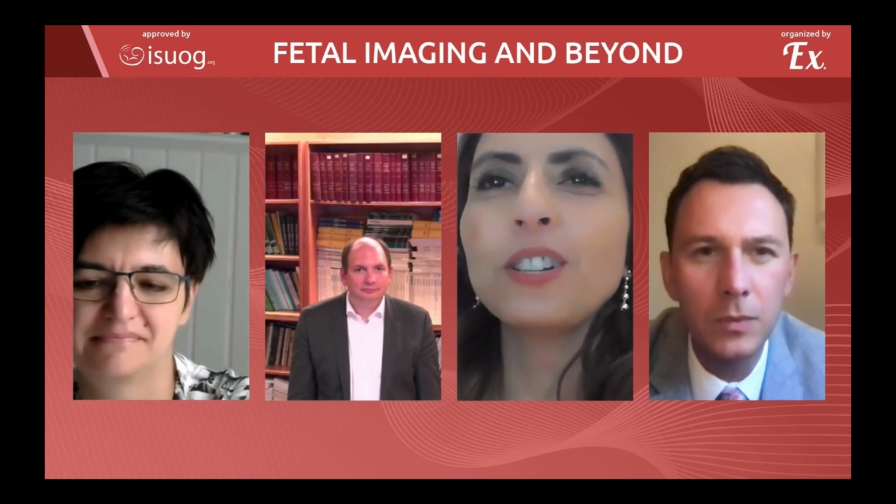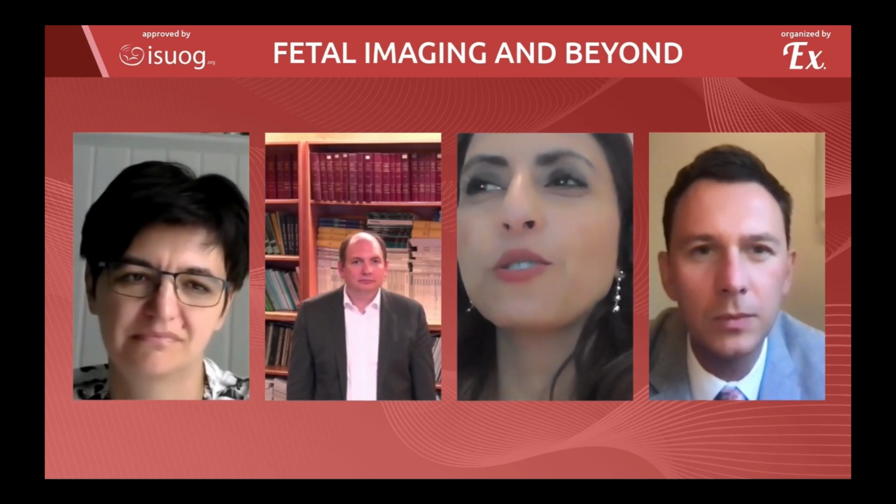There's another question from Mike, and it's not necessarily about intracranial hemorrhage, but it is about MRI. So I think it's a fantastic opportunity that Gregor is with us. So the question: would you recommend doing MRI in case of corpus callosum anomaly? And if you do, what would be the ideal timing in pregnancy?